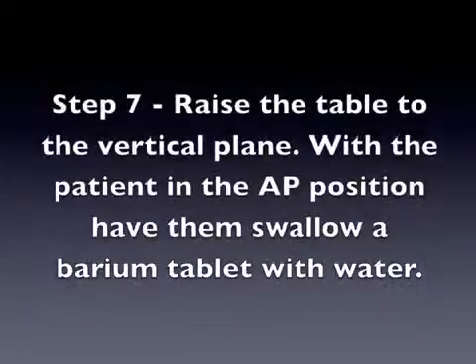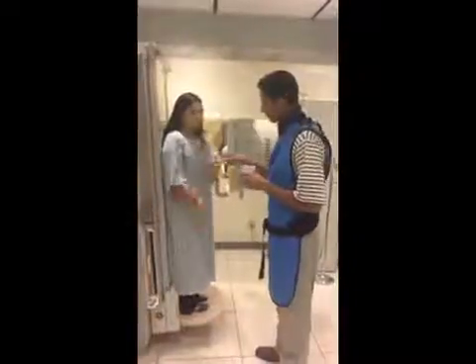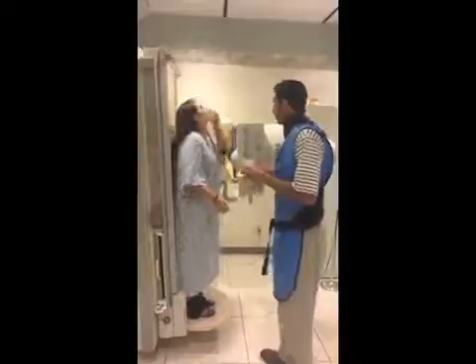Step 7. Raise the table to the vertical plane. With the patient in the AP position, have them swallow a barium tablet with water. Reassure the patient that the barium tablet does not contain any medication.